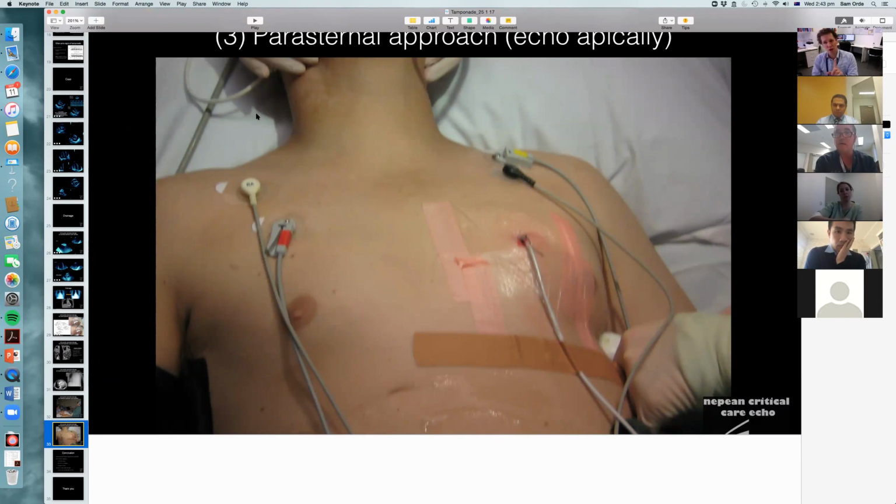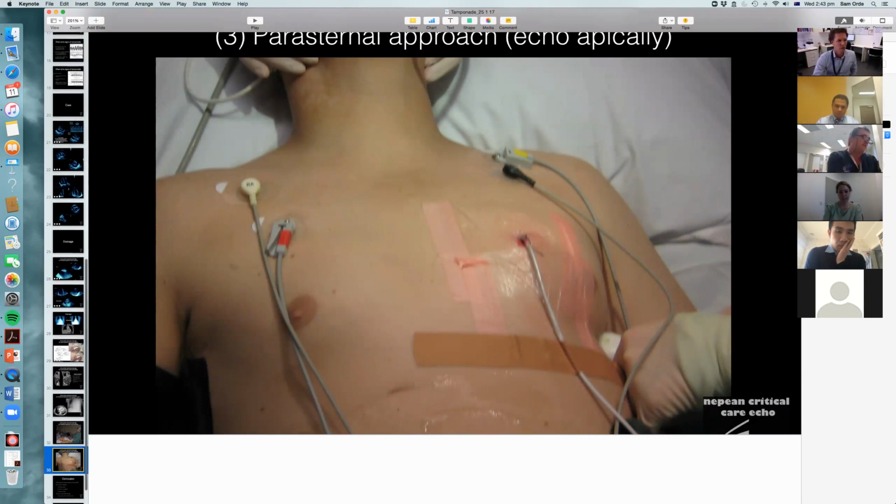But with real-time imaging, from a different window? Well, I don't. No real-time imaging. Real time for me is actually watching where you're going with the needle. I've got someone else putting the echo probe on to do this.